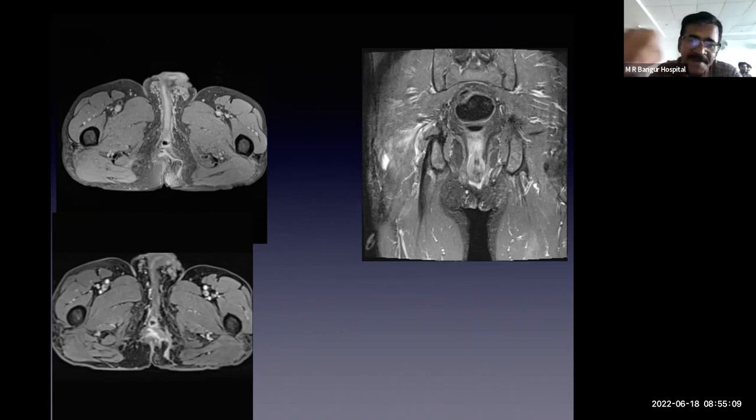Okay. Dr. Rajuri, in that case, which side will we take as the primary? It's a good question. The one that goes straight through the sphincters into the internal opening. So for example, here, the internal opening is on this side. So it goes like this to the internal opening, and then there is a tract, right? So it is a left-sided primary tract.